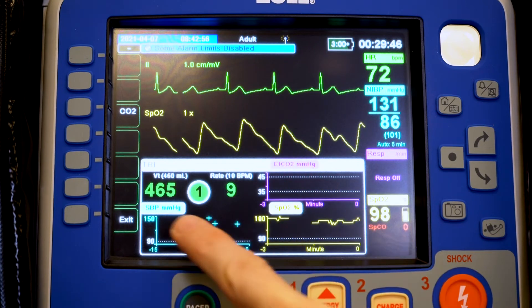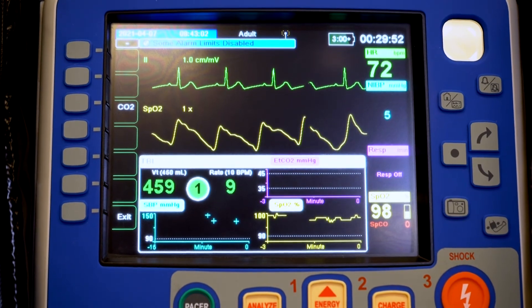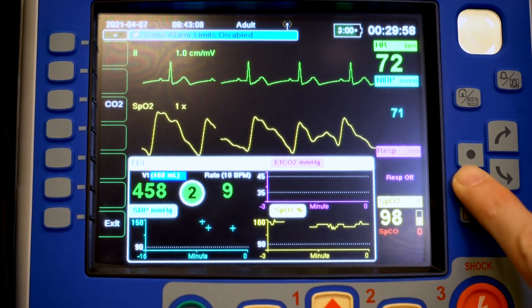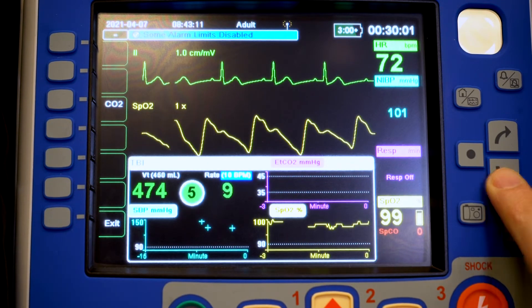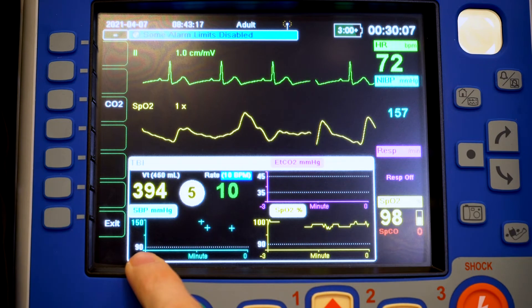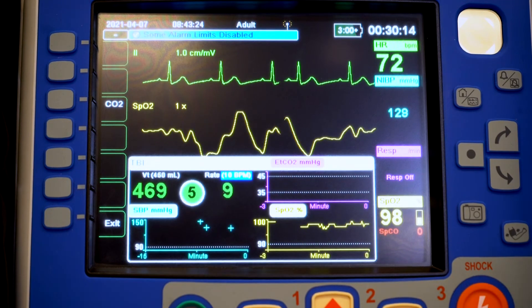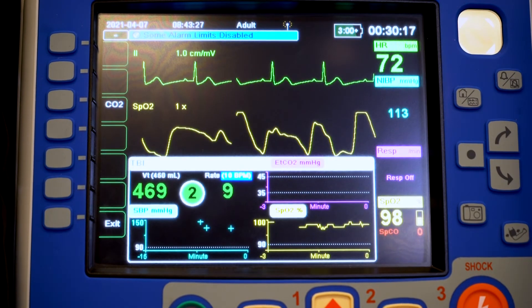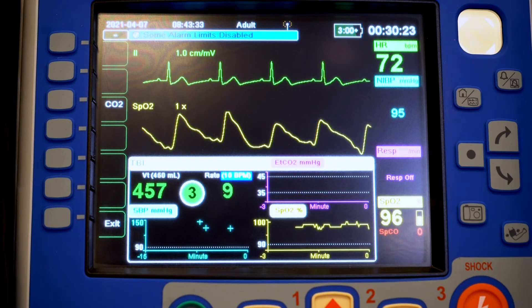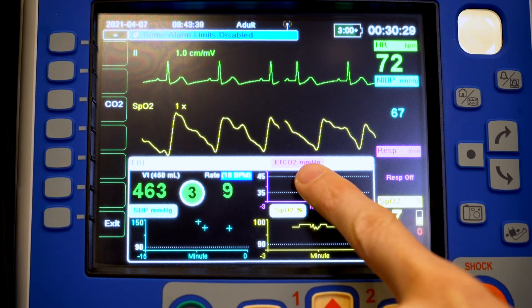With this dashboard we're broken up into four quadrants. Upper left is our real-time BVM feedback feature, and we can make adjustments using the arrows to that field just like before. The next field is our systolic blood pressures, trending over 15 minutes of time. When we turn on the TBI dashboard, we also place the monitor in auto BP mode so that it takes BPs on a five-minute timer automatically and trends them with the plus sign. In the upper right-hand corner we trend end-tidal CO2 over a three-minute timer, trying to maintain between 35 and 45.